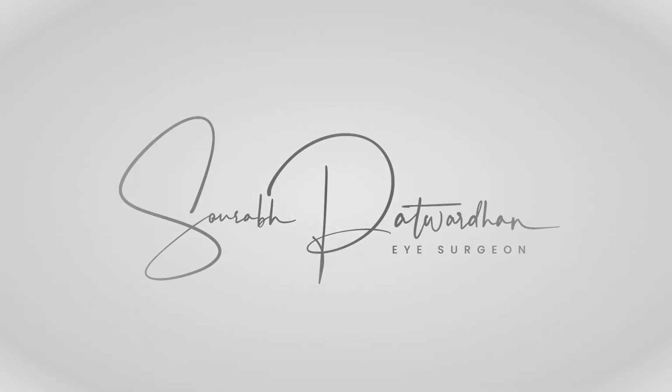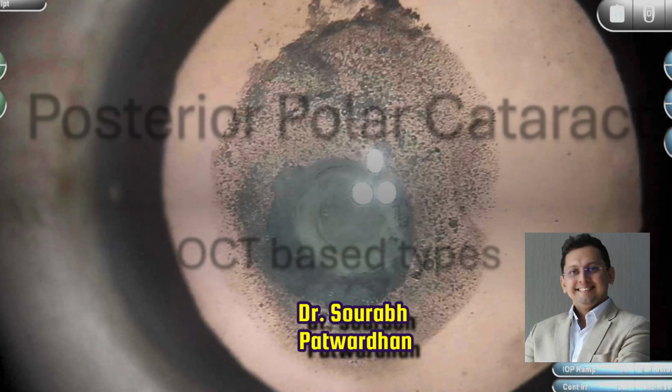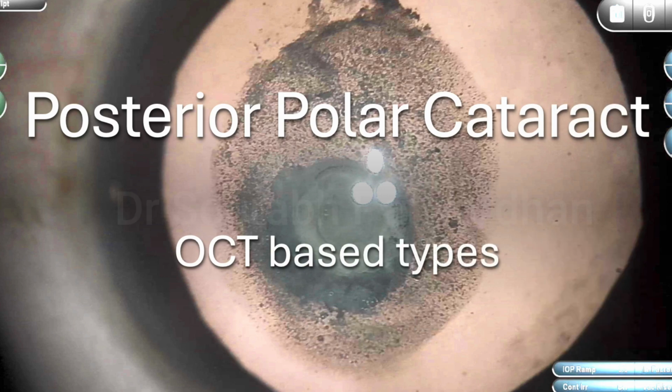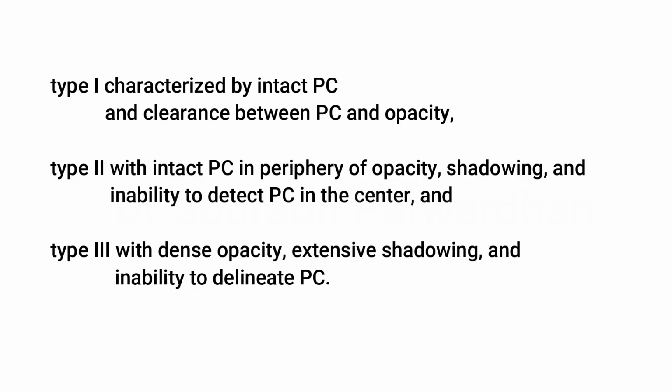In this video, I am going to show a case of type 3 PPC which is being managed by Patwardhan's sideways trenching technique. And before I start the surgical video, I want to give you a brief introduction about the OCT based types of posterior polar cataract. There is a very good paper by Professor J.S. Titiyal and his colleagues showing different types of OCT in PPC.